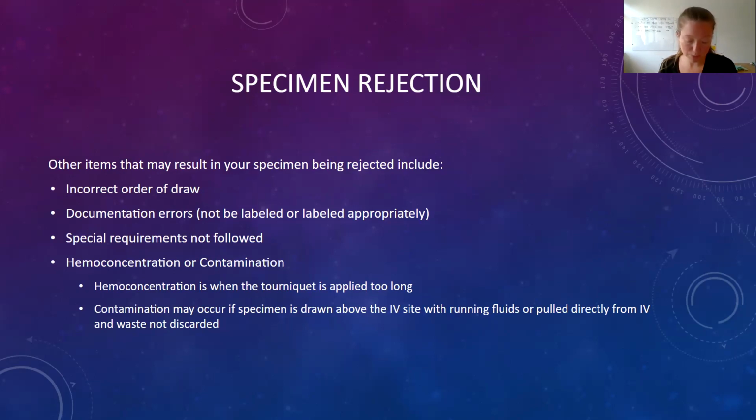So let's talk about icterus and lipemia. That's also in your book. I know I don't have it on the slide here, but icteric plasma and serum appear dark yellow or greenish yellow in color. This is because of an increased amount of bilirubin. Bilirubin is made when red blood cells break down, so hemolysis increases your level of bilirubin. So if you see that kind of dark yellow or greenish yellow appearance in the test tube, this abnormal coloring, just like when we have that red coloring in the test tubes because of excessive hemolysis, can interfere with certain tests and prevent them from being run.